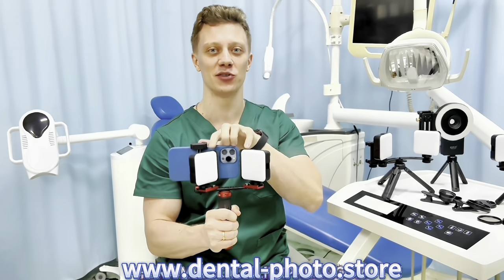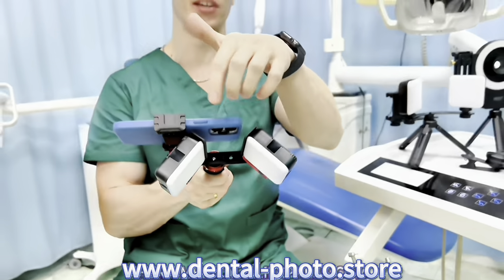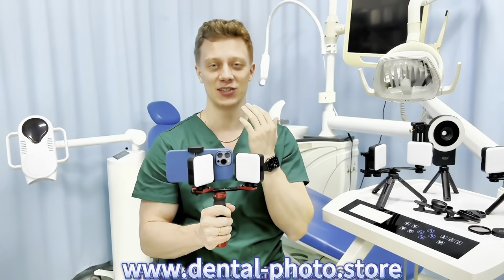First of all, it has two sources of light. They are as close to the phone camera as possible and they are angled. As you can see I'm using the 90 degree angle and you can adjust it. This is very important to get rid of the shadows inside the oral cavity.